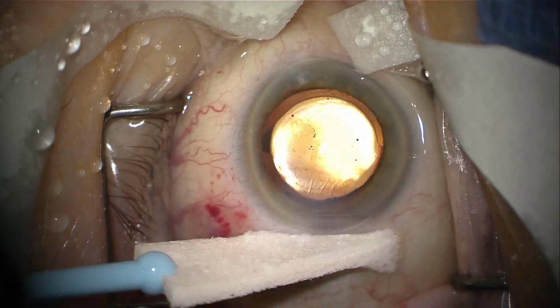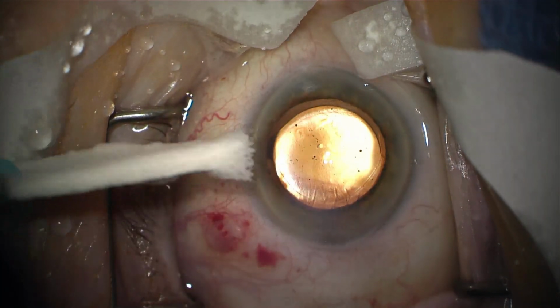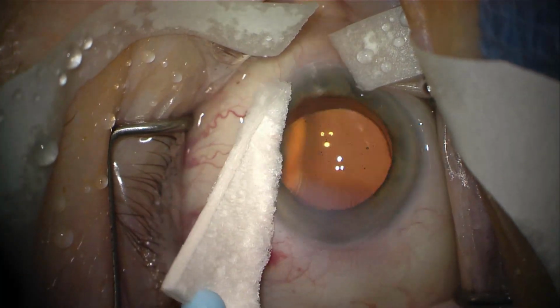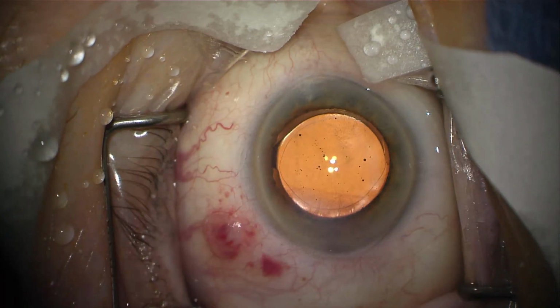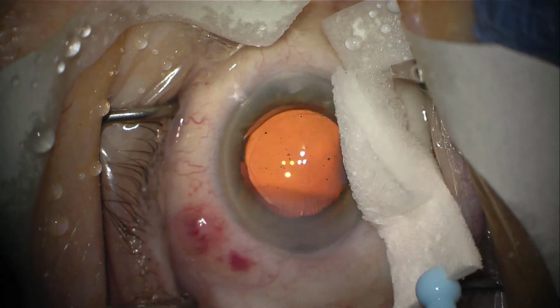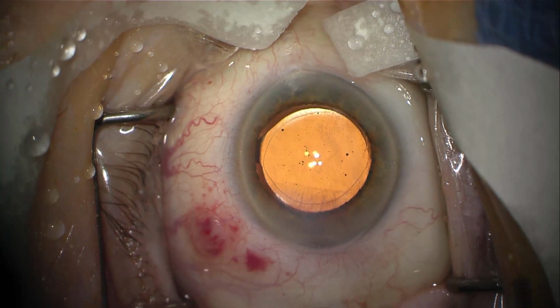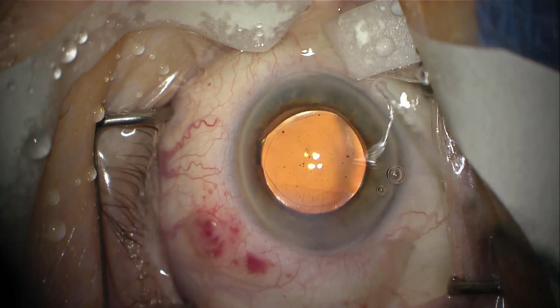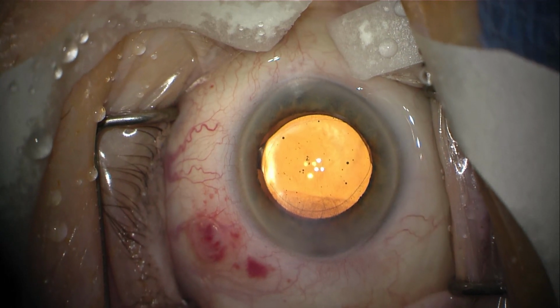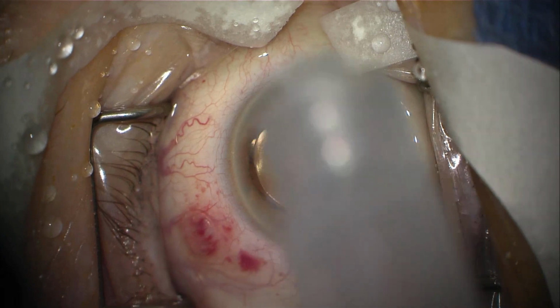What I want to do now is make sure that all my incisions are completely sealed so there's no leakage of fluid from inside the eye. So I'm using this triangular sponge to press on the incisions that I initially made, just to make sure that there's no fluid leaking out of the eye when I press on the eye. Keep in mind the patient does not feel any of this because the eye is completely numb with those lidocaine drops that I've been applying every 2 or 3 minutes during the entire procedure.